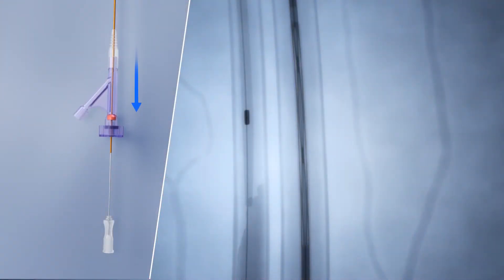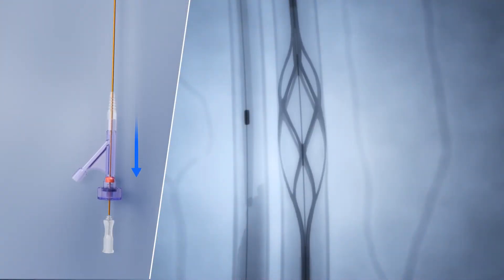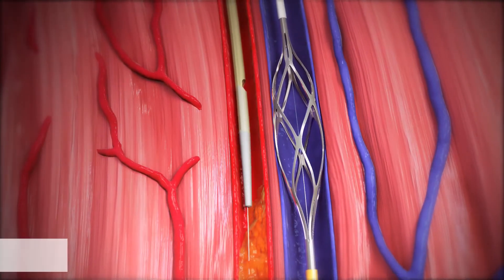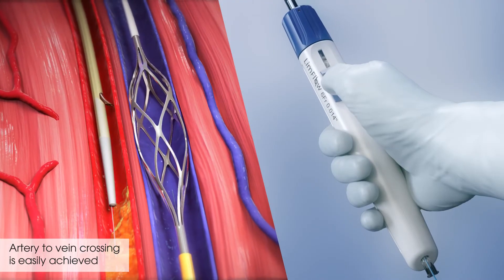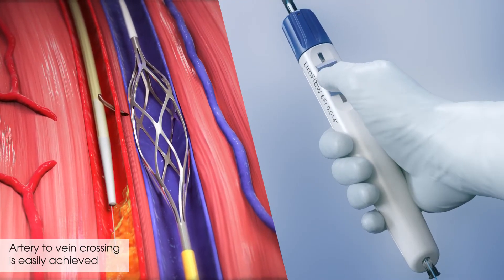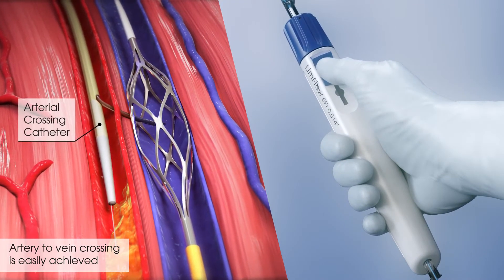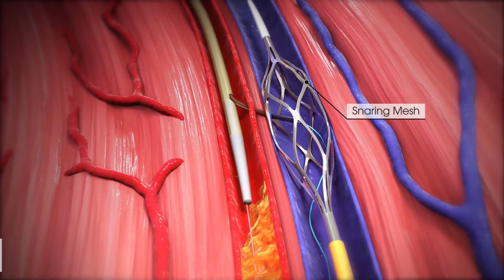Then, the snaring mesh on the venous catheter is deployed and the venous and arterial catheters are aligned. Artery-to-vein crossing is easily achieved by advancing the needle from the arterial crossing catheter into the snaring mesh of the venous catheter.